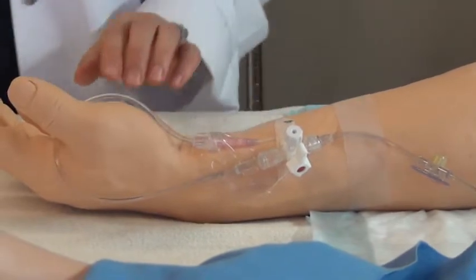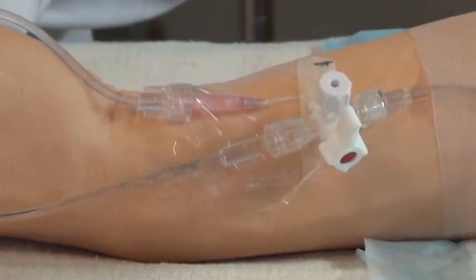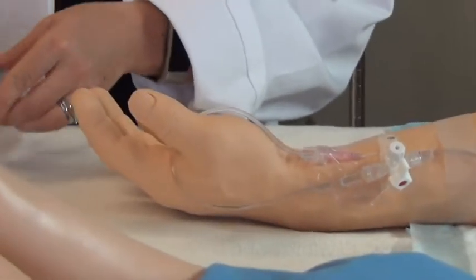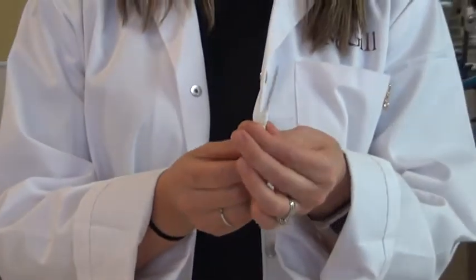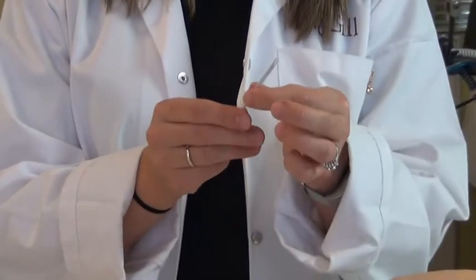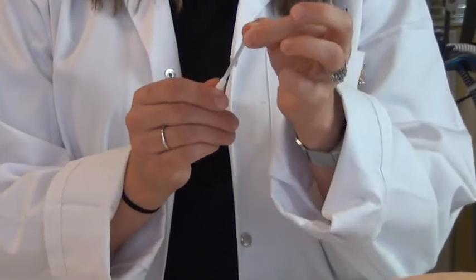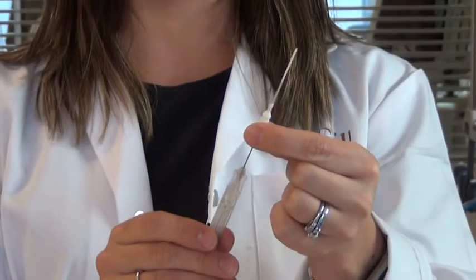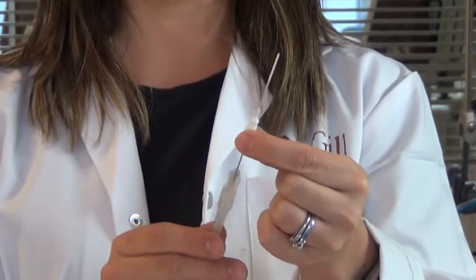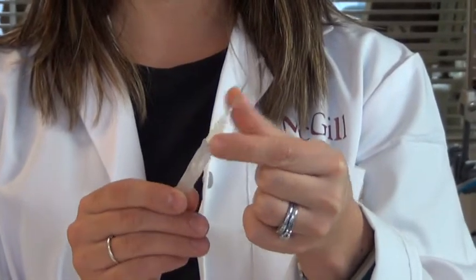Now, you see that this catheter is actually an IV catheter, but generally a catheter that is used for an arterial line is slightly different. It is a 20 gauge thick catheter with a flexible tip, and it's slightly longer than a regular IV. So it does look like an IV, but the material that it's made from is also different because we need to be able to sense pressures through this catheter.